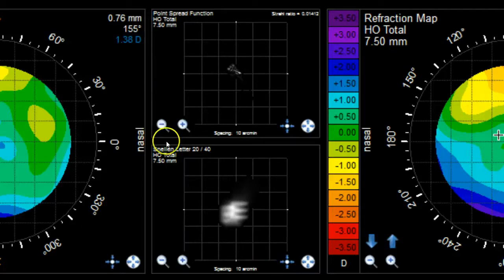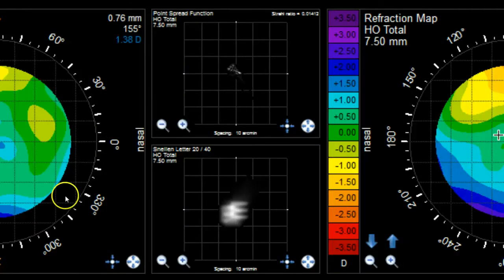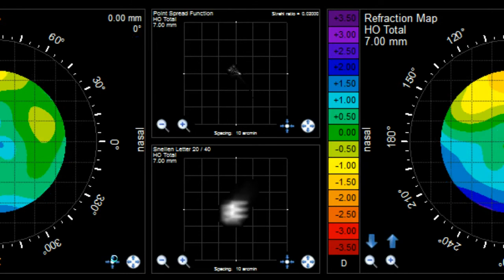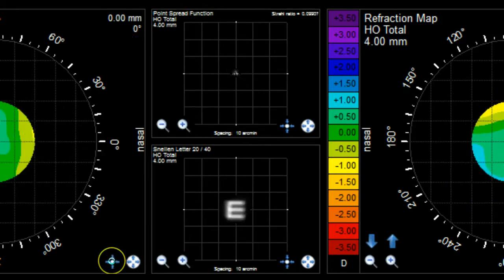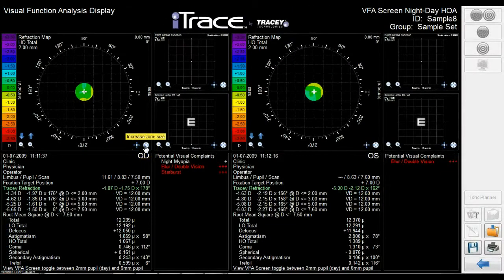These panels display the patient's point spread function and a simulated Snellen E. They illustrate the patient's vision with all lower order aberrations corrected. In other words, this is a simulation of how the patient will see when corrected with traditional spectacles or contact lenses. But this simulation is at the patient's scotopic pupil size. By clicking on the zone size selection buttons, you can illustrate the changes to the Snellen letter or PSF based on the patient's pupil size, showing the night myopia issues present in their vision.